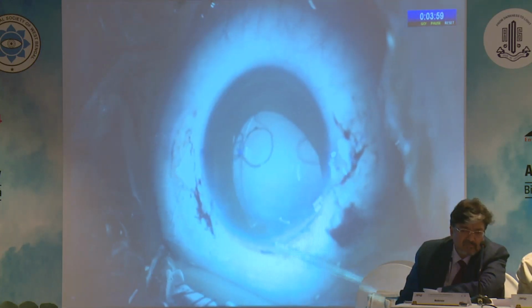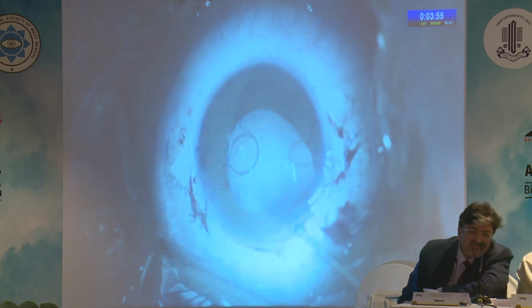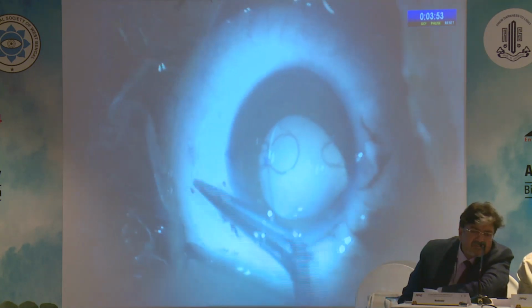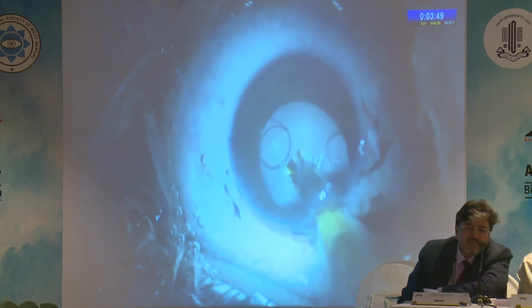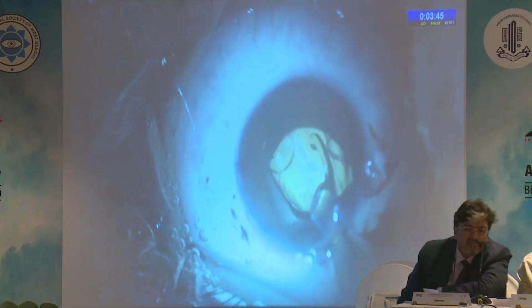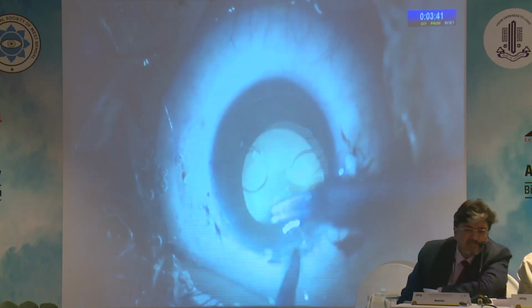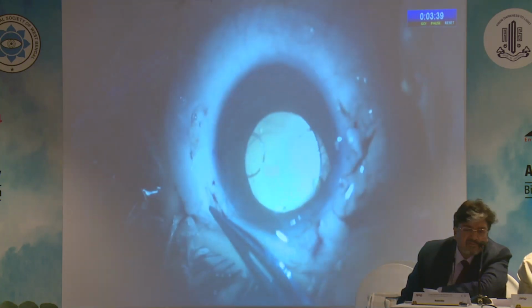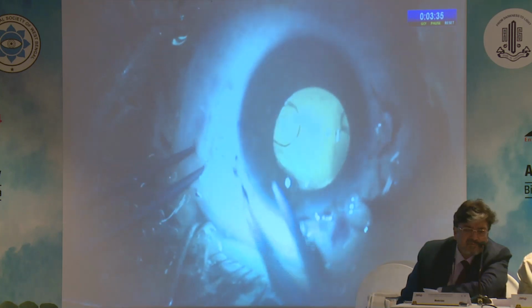The comma-shaped central eyelet is placed anterior to the capsular bag and the remaining 2 eyelets are dialed into the bag using the Sinskey hook or the Y forceps. After enlarging the main incision, we place a single-piece hydrophobic acrylic foldable intraocular lens inside the capsular bag. The IOL, leading and trailing haptic are dialed well into the capsular bag and the IOL is starting to maintain a good central position.